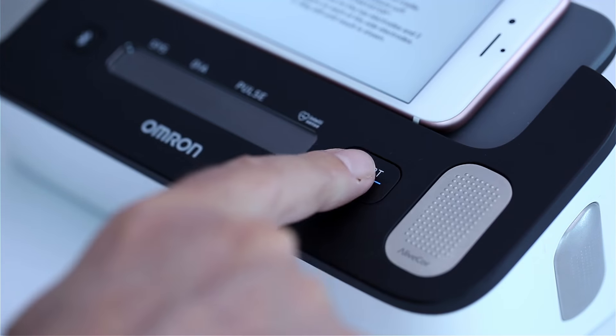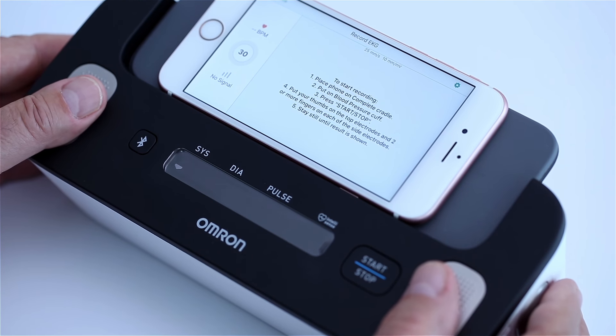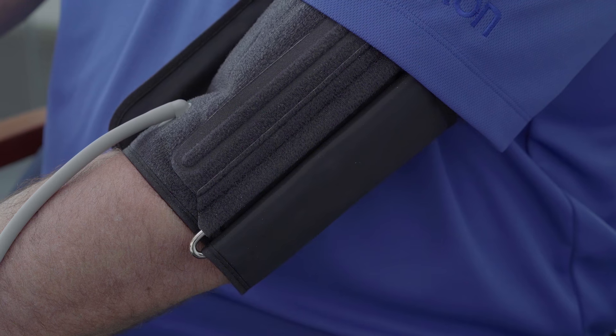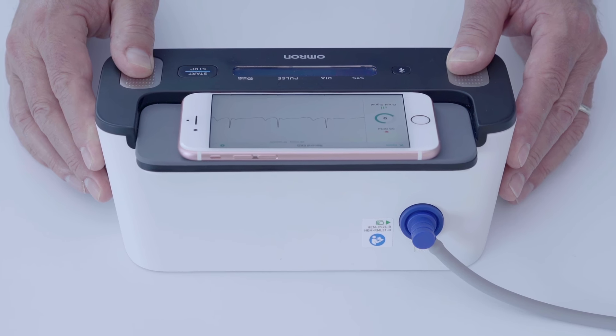Step 6. Press START on the monitor to measure blood pressure and place your thumbs on the top electrodes and two or more fingers on the side electrodes. Remain still and do not talk until the arm cuff deflates and the 30-second countdown for EKG recording on your smartphone is complete.